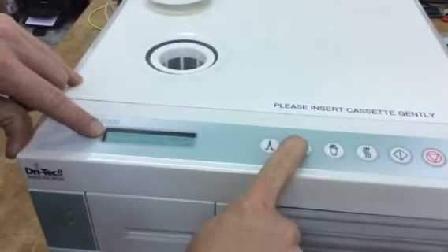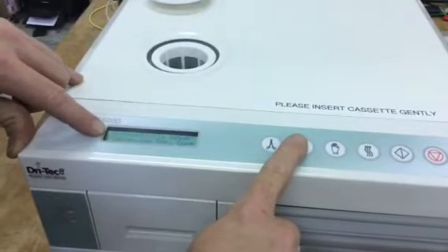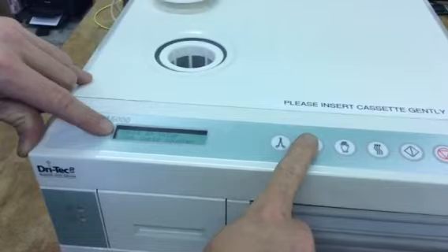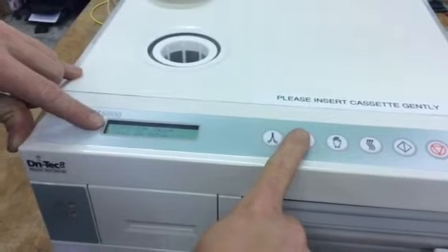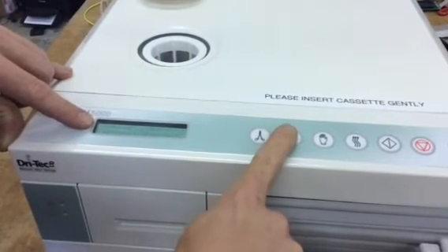For this particular one we're going to show you how to calibrate. If you're getting a cycle fault 16 or cycle fault 26, the first thing I would recommend is that you run an empty cycle with no instruments in the cassette. Also make sure that your exhaust tubing is not kinked or pinched. You're going to scroll until you see calibration.